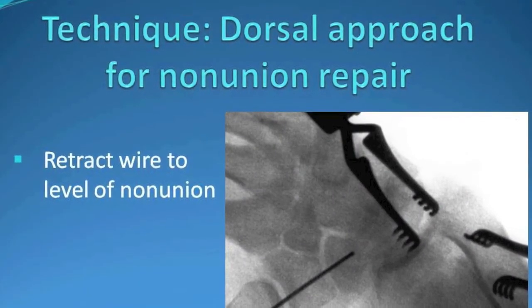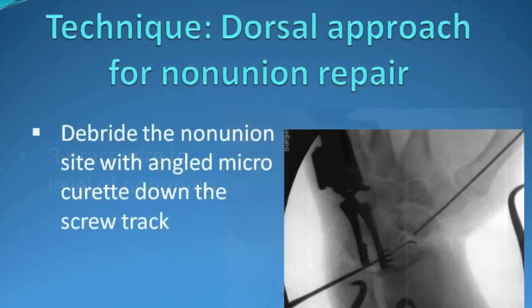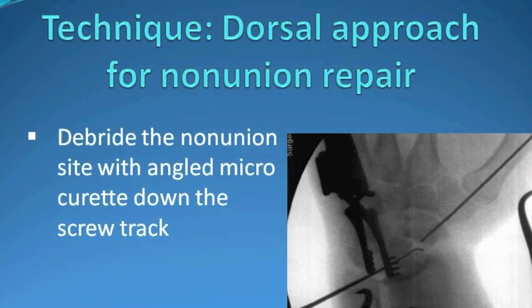After drilling the scaphoid over the guide wire, the guide wire is retracted to the level of the nonunion. This gives access to the nonunion for debridement and ultimately bone grafting.